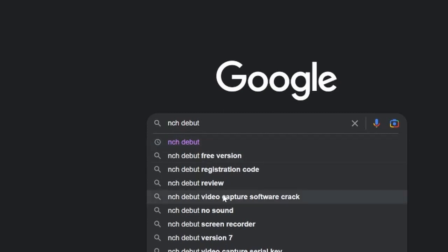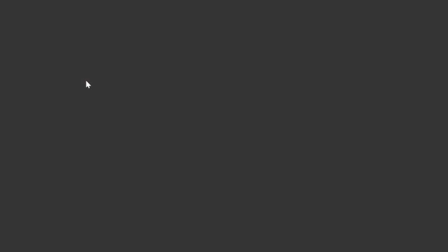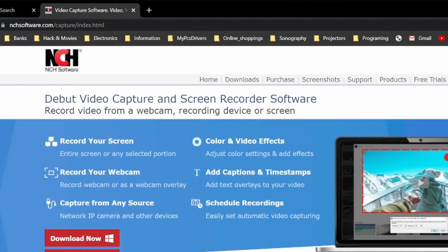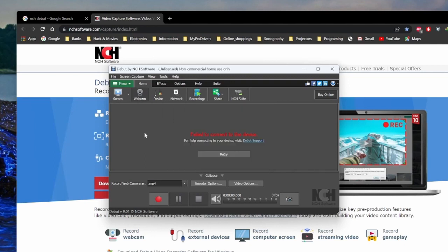Download for Windows — click the download link — and here is the file I received after downloading. Click this file and you will have the software installed like this.